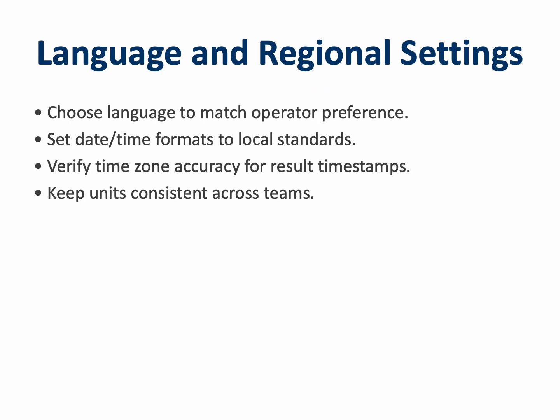Language and regional settings may seem minor, but they affect usability and documentation accuracy. Select a language that matches the operator's familiarity to minimize menu errors. Next, confirm that time and date formats match your facility's reporting convention, typically DDMMYYYY in the UK. Accurate timestamps are vital, as each test result is stored with a digital signature tied to date and time. Incorrect settings can lead to confusion during audits.